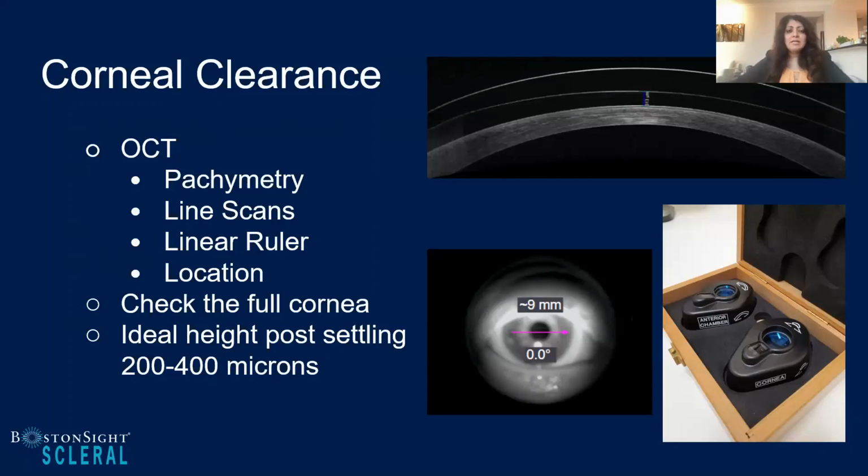I think the key thing when you're looking at corneal clearance is to make sure that you don't just look at the center. I have this diagram right here where we have a scan right across the center. You want to make sure you look at all areas of the cornea. I have it set that we do 5 measurements throughout the length of the cornea, because when you're dealing with irregular corneas, you're not dealing with an even cornea where you're going to get the same amount of coverage from top to bottom. So just make sure you look at all areas of the cornea.